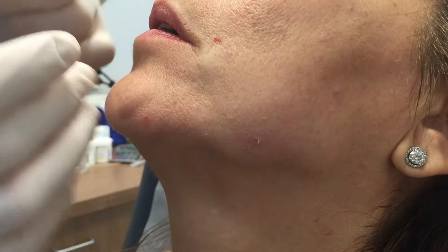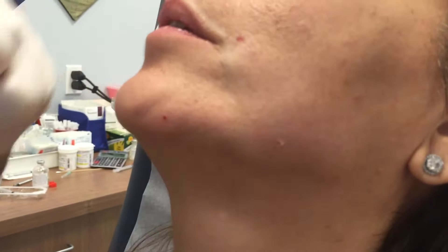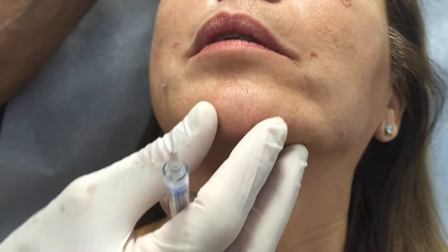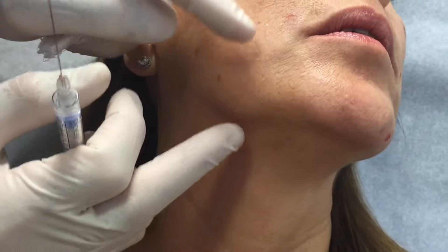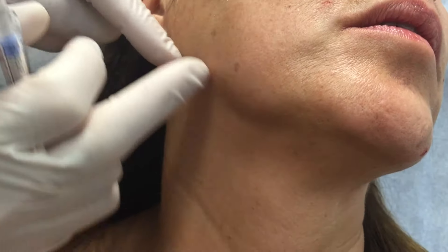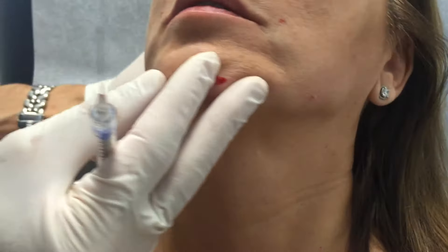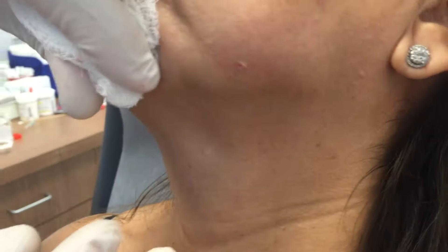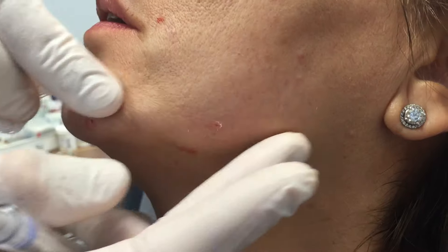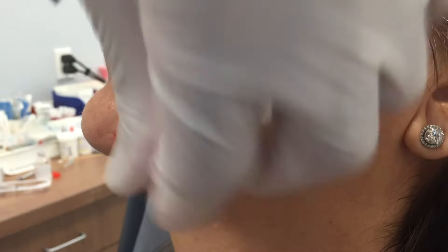I tell my patients if we can make it look a good forty percent better, then they're usually very happy with that expectation. If you take a look at how this looks and then come around to this side — this side is not done yet — you can see the fullness of the jowl and the volume loss before and after. You can see how that jowl is very well diminished by putting the Radiesse before and after it.